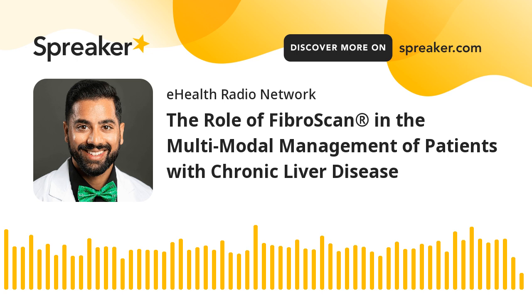And now with FibroScan at the focal point, this device is part of a fatty liver clinical care algorithm at our institution. Via open access and health screenings, various providers are directly ordering FibroScans for their patients and determining where to refer them next. This has led to the multi-modal management of patients for chronic liver disease at our institution.